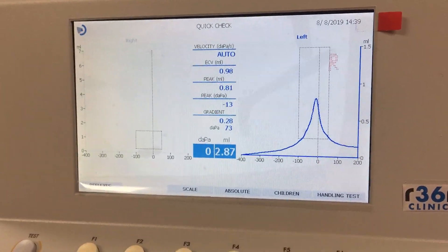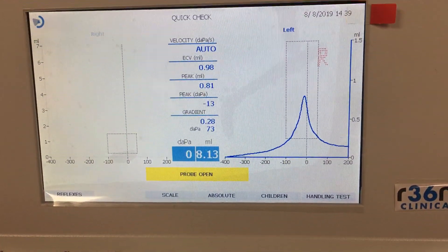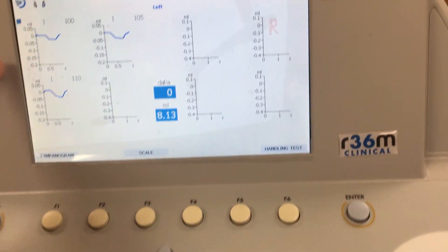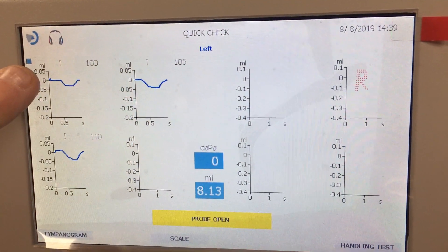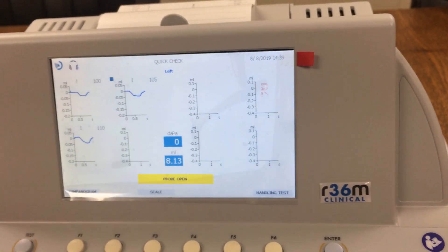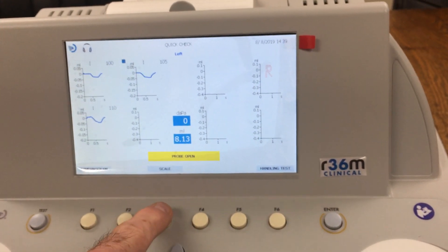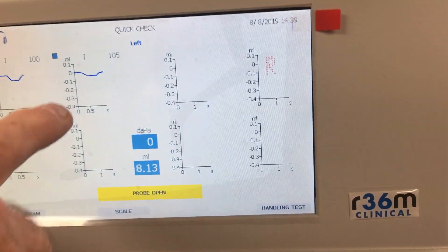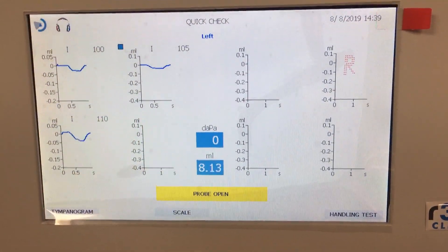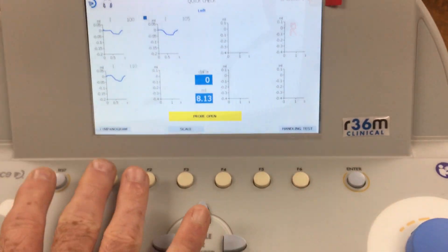Running a quick check on the left side — you can see we ran both a tympanometry and a reflex test. To view your reflex test results, click there and you'll see them displayed. Notice the blue dot — wherever the blue dot is, you can move it to whichever frequency you want to look at. Use the scale button to scale the numbers and get a better look at the results. Then you can go back to the tympanometry view.